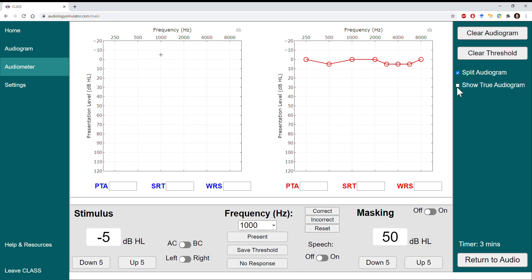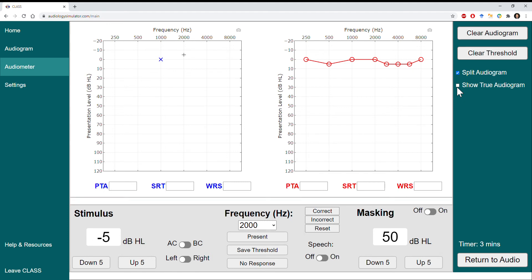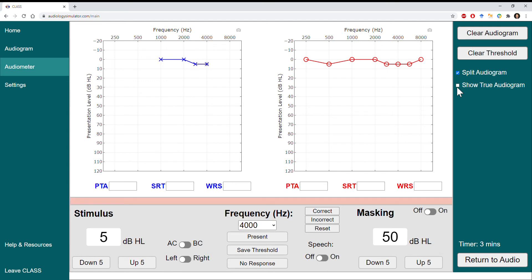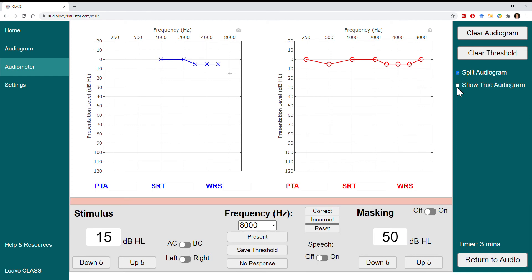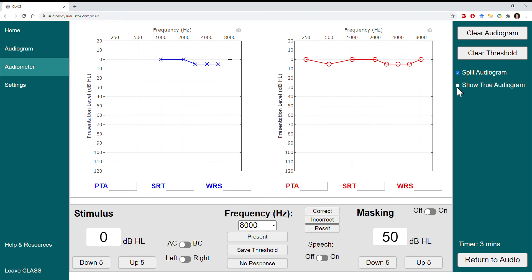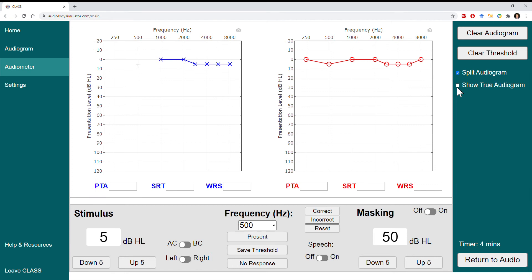I'll follow the same procedure to find the thresholds in the left ear. This time I'll skip rechecking 1000 Hz just to be judicious about the time spent on this video.